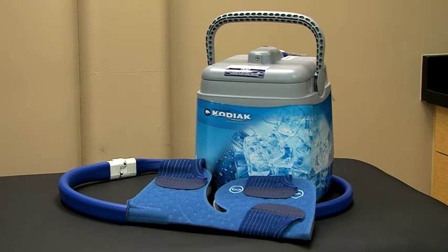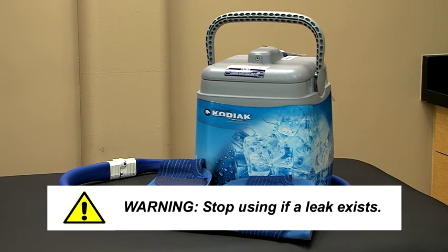In the unlikely event water leaks from any part of the unit, pad, or connection, stop using the unit and contact your local Bragg sales representative or Bragg customer care.